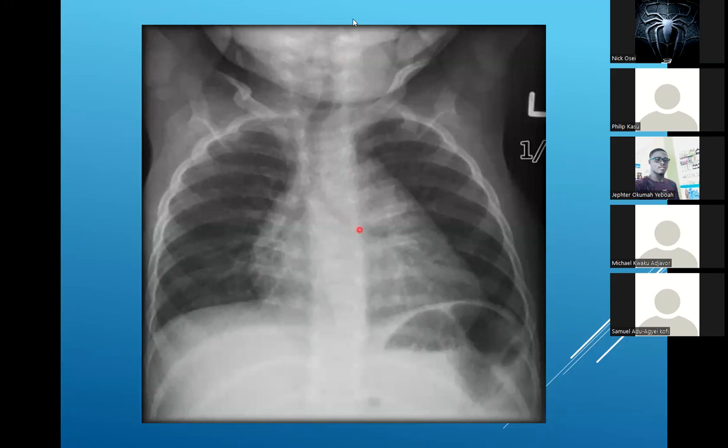Okay, Solomon Ade, can you please comment on this X-ray for me? Hey, where's Solomon Ade?